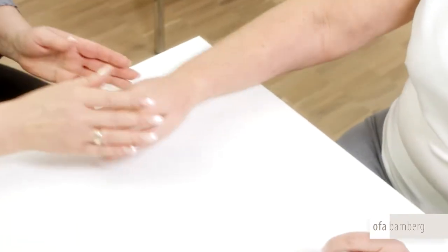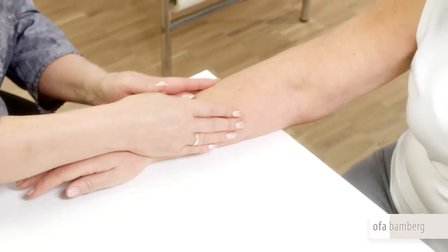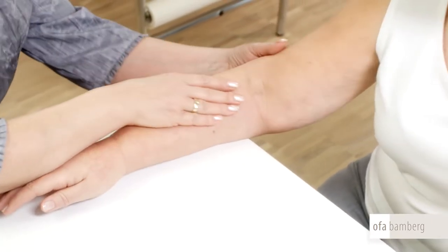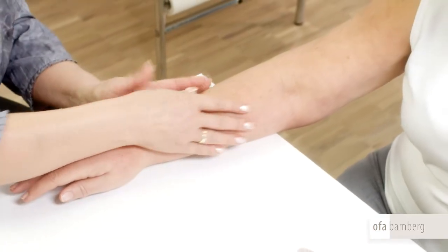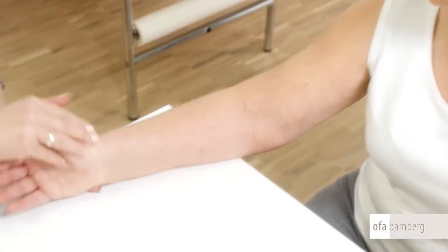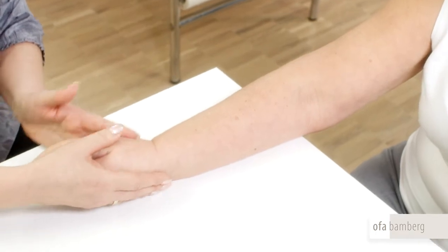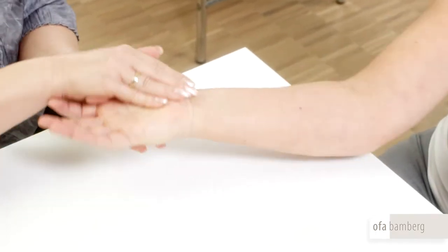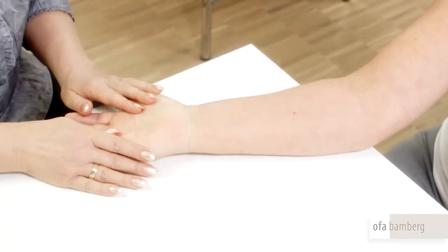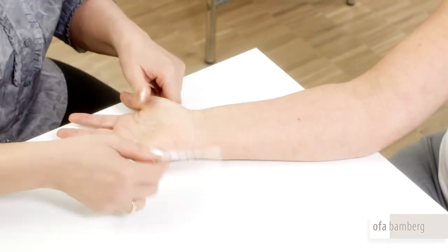First, feel the arm carefully to check if it is totally decongested. The firmness of the tissue, thus determined, also decides how much stretching is required when measuring. In the case of soft tissue, you must tighten the measuring tape, whereas in the case of firm tissue, it should be somewhat looser. Also, pull more firmly on the measuring tape should the edema be pronounced, and less firmly if the edema is less pronounced.